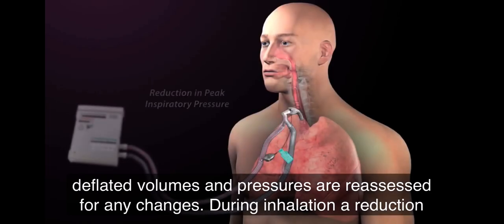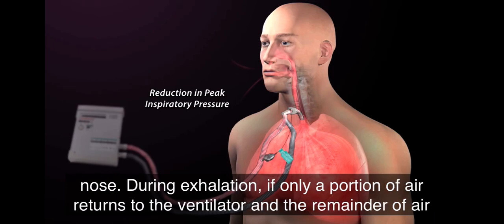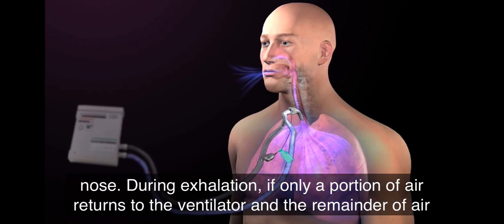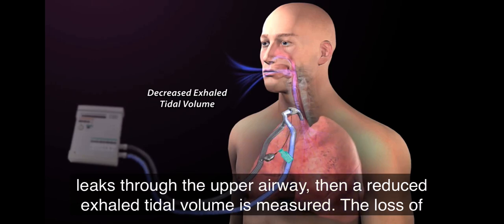During inhalation, a reduction in peak inspiratory pressure may be observed as volume escapes or leaks through the mouth and nose. During exhalation, if only a portion of air returns to the ventilator and the remainder of air leaks through the upper airway, then a reduced exhaled tidal volume is measured.